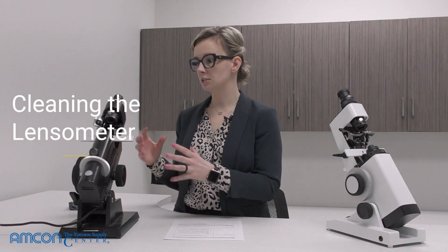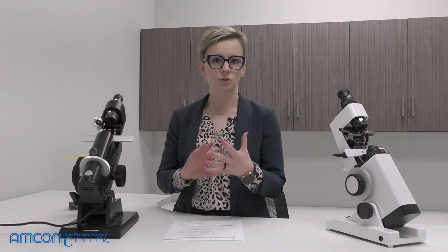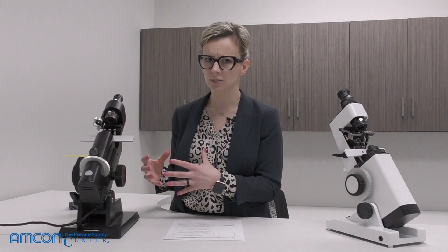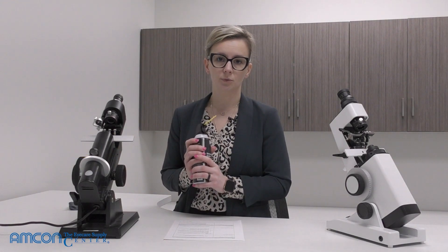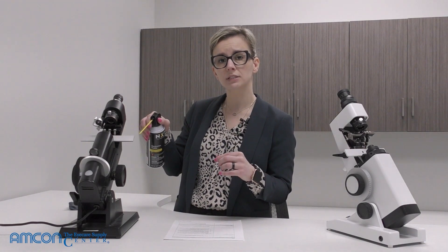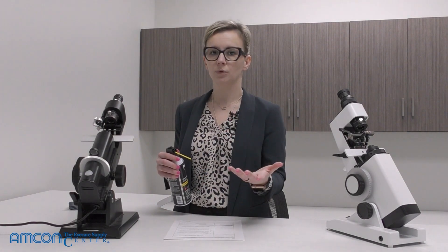One of the most important things about general care of a lensometer is making sure that it is clean. Your eyepiece and lens stop shouldn't have any debris, dust, fingerprints, or scuffs on them. To get debris and dust that may have settled into crevices, compressed air is the way to do that. The nozzle can reach any crevice that a cloth or duster wouldn't be able to reach.